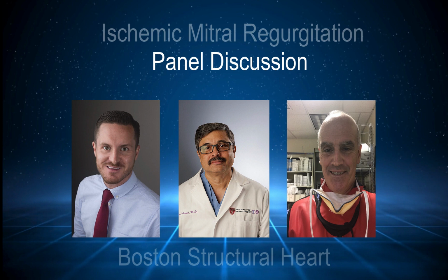If I was to have a crystal ball and say there's one thing in echocardiography that needs to be the innovation for the next 10 years, that would be getting the actual flow information in the images. Right now we use velocity maps as indirect surrogates for volume maps.